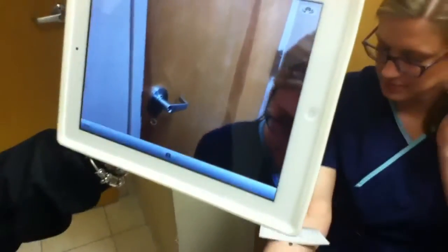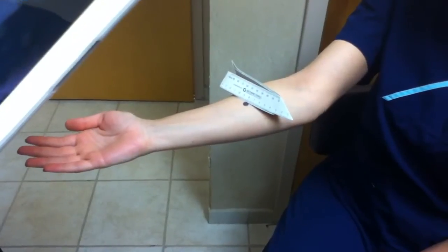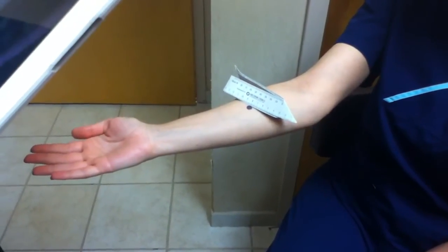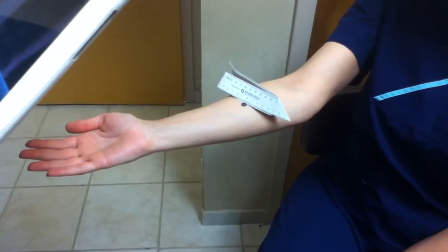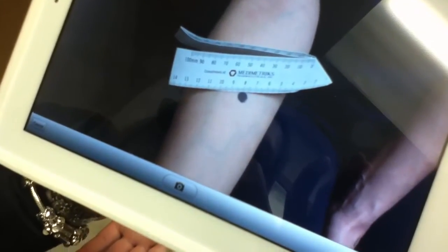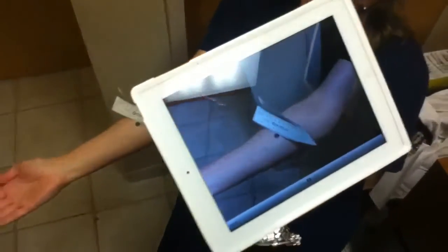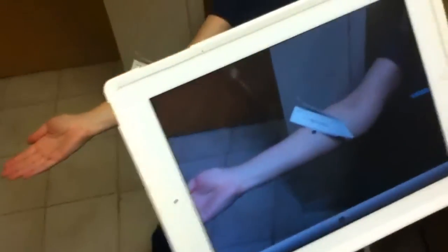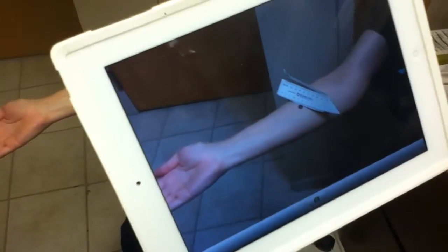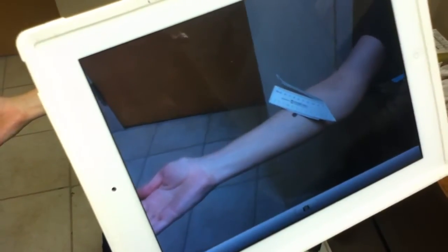Caitlin is going to look down at our subject's arm. The picture should be wide enough that you can see the anatomic landmarks — in this case the antecubital fossa, the hand, the palm, the wrist, and so on. You can be too close and not be able to have an idea where on the extremity or the body the lesion is located. Swing around a little bit to take the picture from an angle that gives you a full shot of the right upper extremity. We've placed a ruler next to the lesion so that the scale of the lesion can also be estimated.